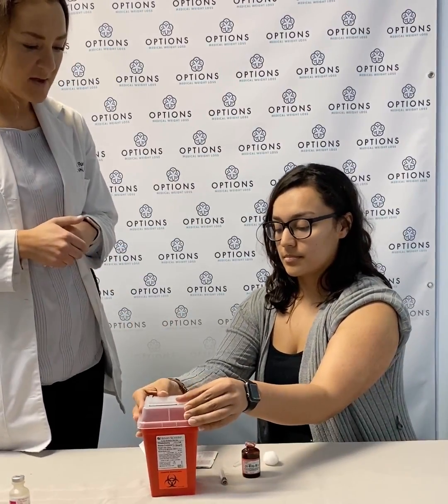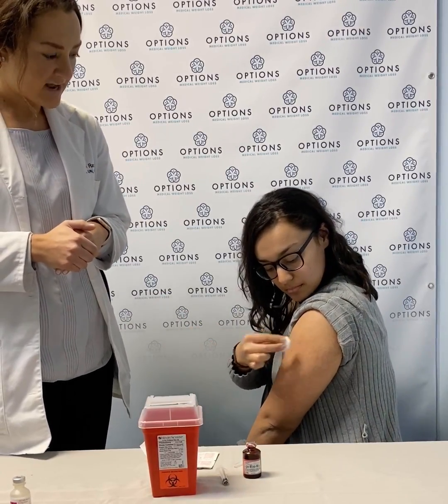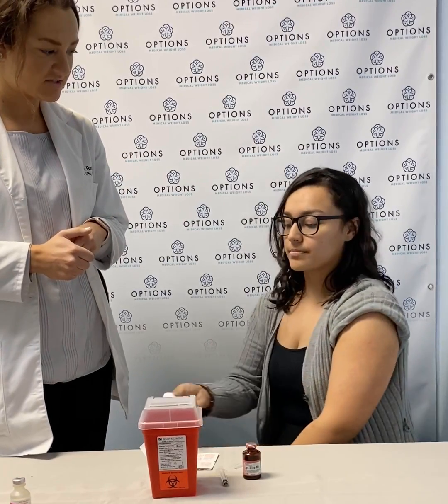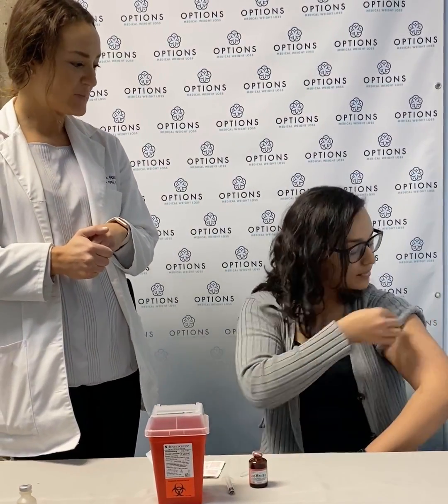There is a cotton swab here as well to get any sort of liquid or drainage that might come out after. But it looks like she is just great — she doesn't have anything. So that is our self-injection of the lipotropic.